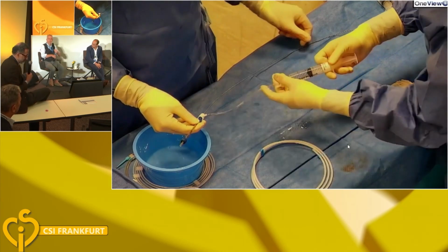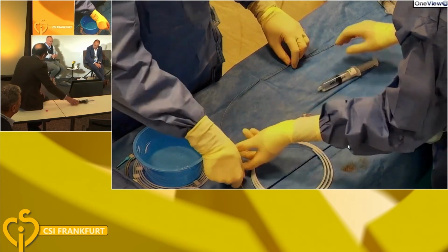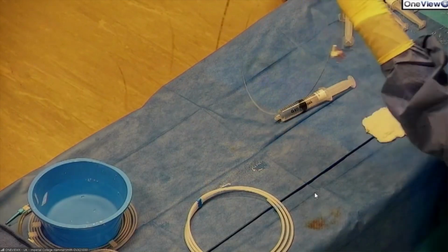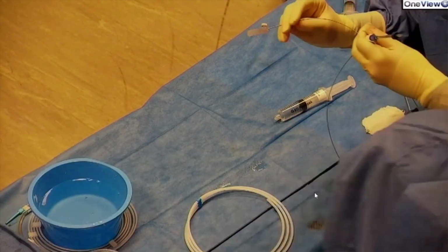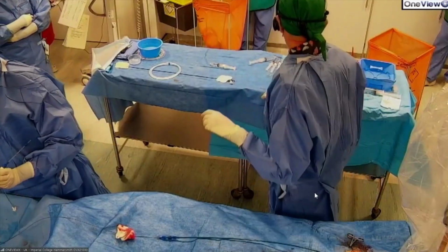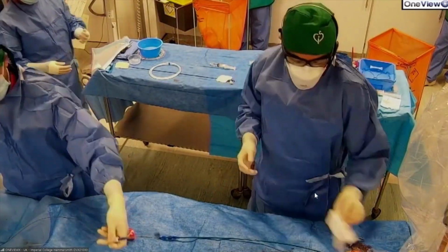No. It's hocus pocus. Oh my God. I think we learned that a bit from the early Occlutech devices. The cobra shape was a problem, and we learned that stretching them out reduced the rate of that. I think obviously now that's less of a problem, but we've carried on doing it. PFO device, can you really?